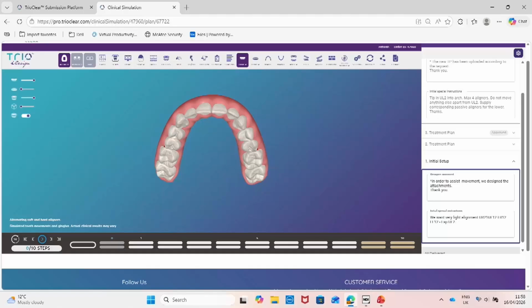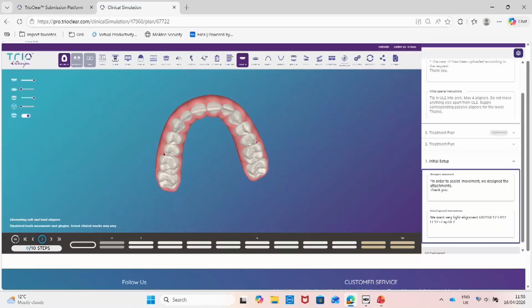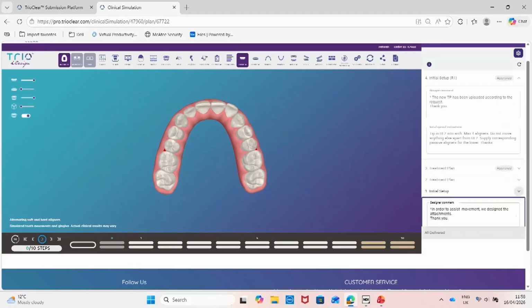I just became aware in this plan that this patient had absolutely no problem at all with everything on the upper right 2, 1 and the upper left 1. His sole focus was this upper left 2. So I was just looking at this case critically and saying, do we really want to move any of this if it doesn't concern the patient? And that's about simplifying it. So what we're able to do is instruct in effect a refined plan.